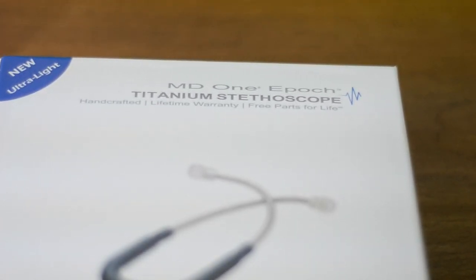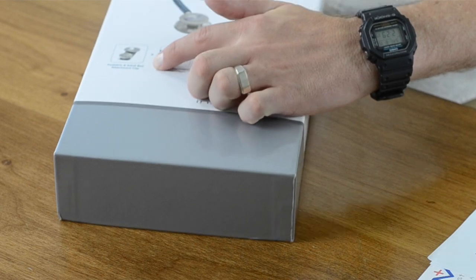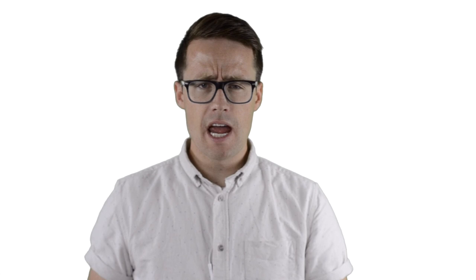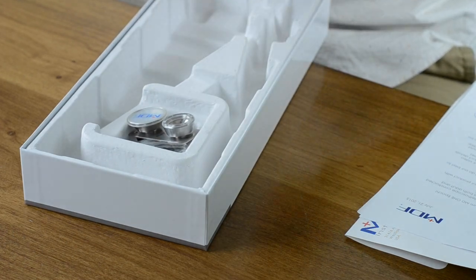On the box we see MD One Epoch titanium stethoscope, handcrafted lifetime warranty, and free parts for life. It looks like it comes with interchangeable diaphragm and bell components for both adult and pediatrics. And then pulling this thing out of the box, it feels almost like holding one of those disposable stethoscopes that you see beside a patient on contact precautions — it's that light.